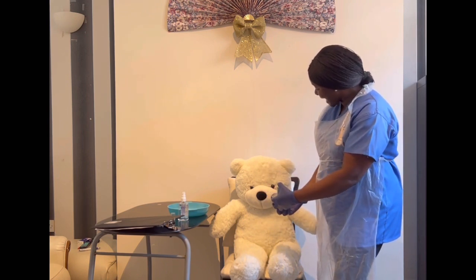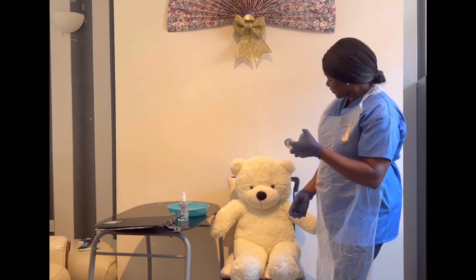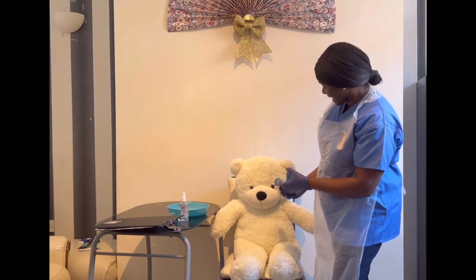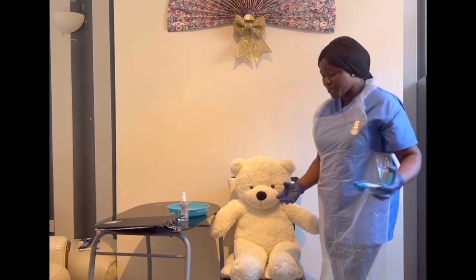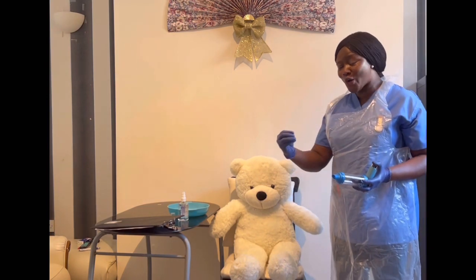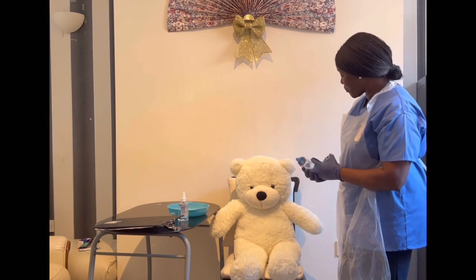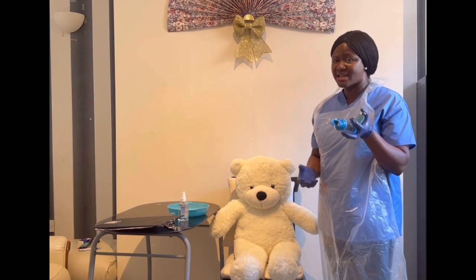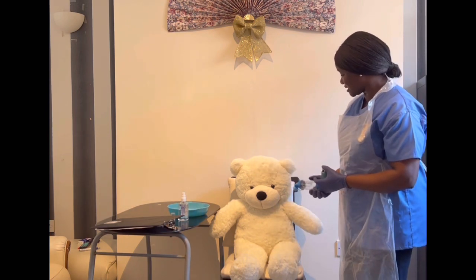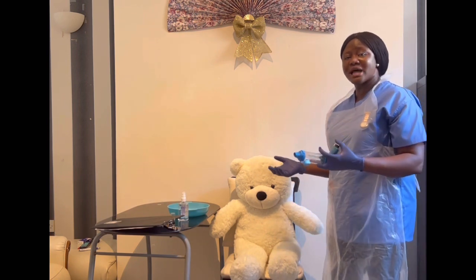As I depress the canister, you hold your breath for 10 seconds or as long as your lung capacity can carry. I remove the spacer device, then you breathe out slowly through pursed lips. It's the single breathing technique, and because we're using a spacer device, that's what I will advise that we go for. Is that okay with you, Harry? Yes, nurse.